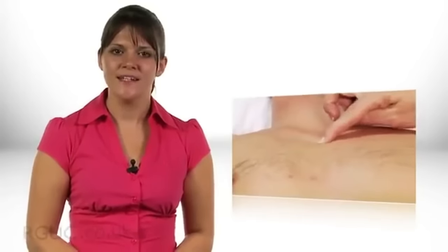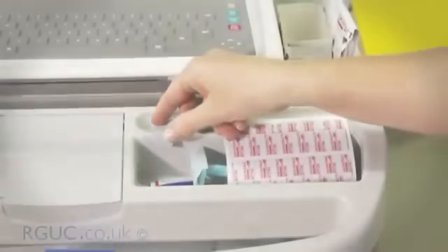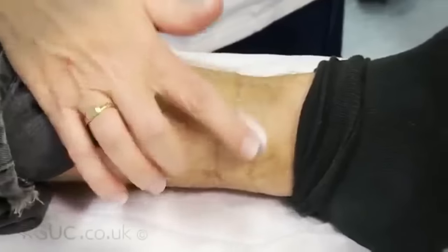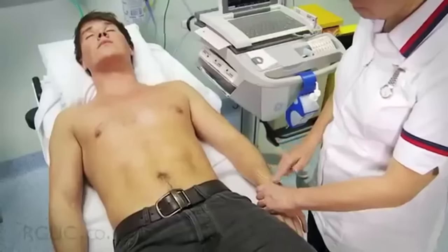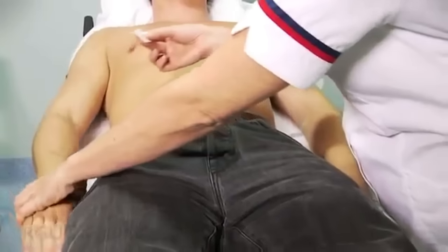Identify the site of attachments for the electrodes accurately and at these sites prepare the skin. This is required to ensure good contact and therefore produce an artefact-free and accurate ECG trace. If required, use a razor to remove hair and dispose of the razor in a sharps bin. Using the abrasive preparation pad, lightly exfoliate the skin surface. Using the alcohol-based cleansing wipe, clean the skin over the exfoliated sites and dispose of the wipe in a clinical waste bin.